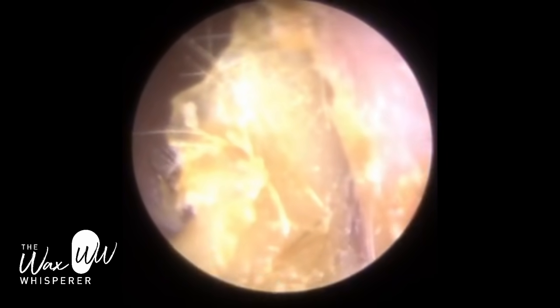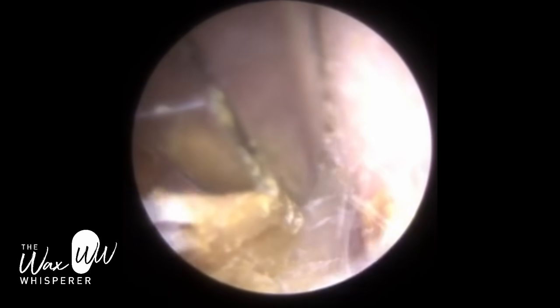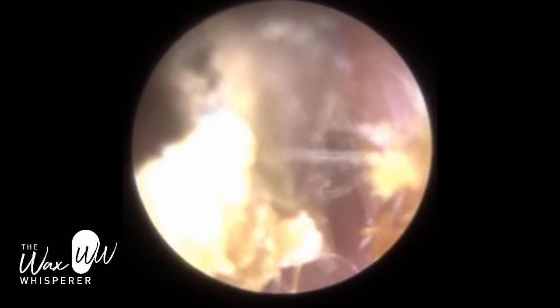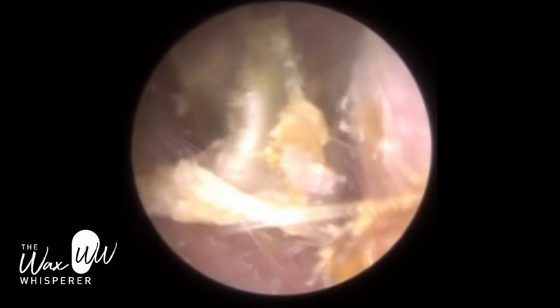Just using a combination of suction and forceps now. This skin is extending more medially, deep into the ear canal and the bony part. However, it's still very, very thick - unusually thick. And even with the forceps, I'm really grabbing onto it, trying to pull this off.